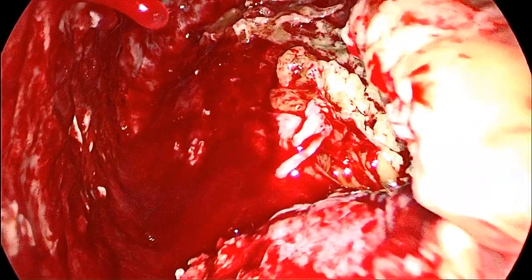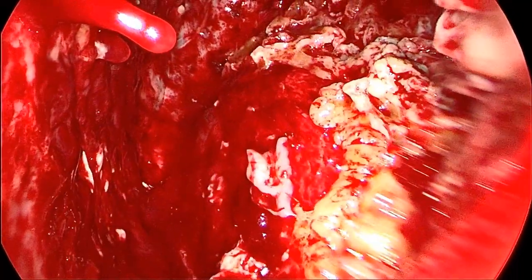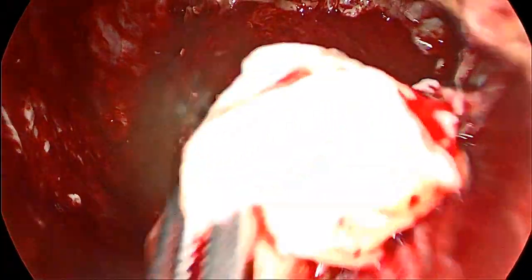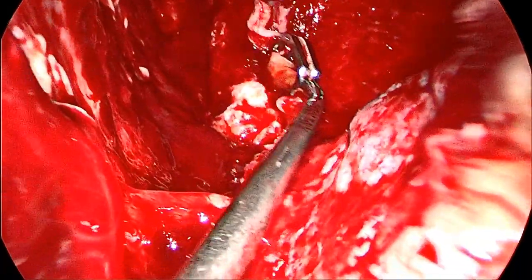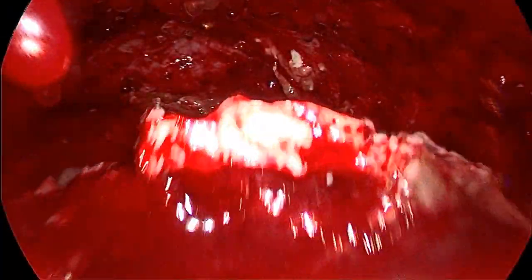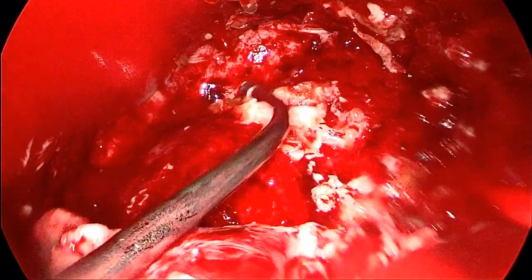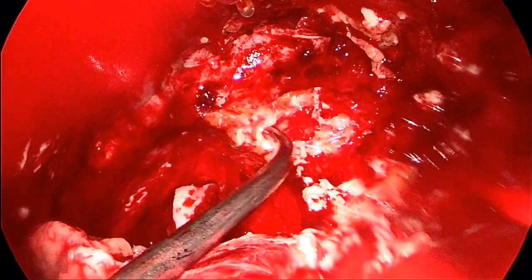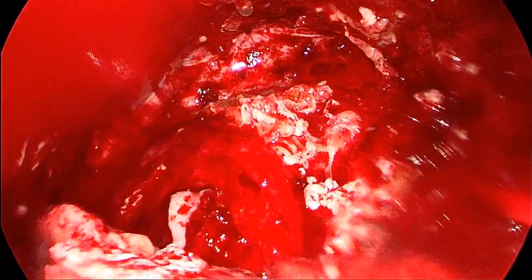After freeing the lower lobe from the diaphragm, we start to remove the biofilm from the diaphragmatic surface, keeping the movements very controlled.